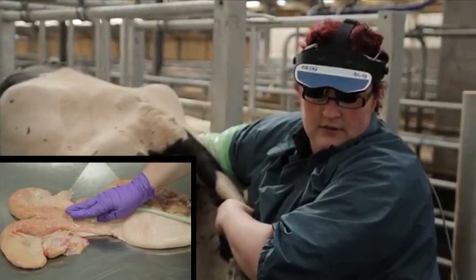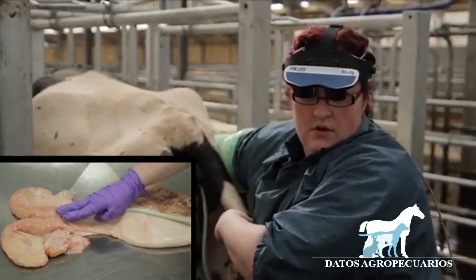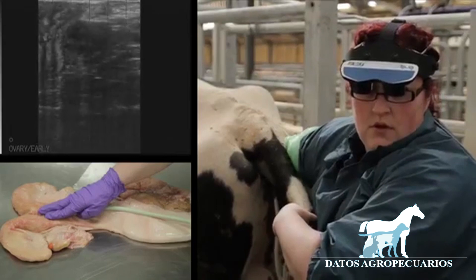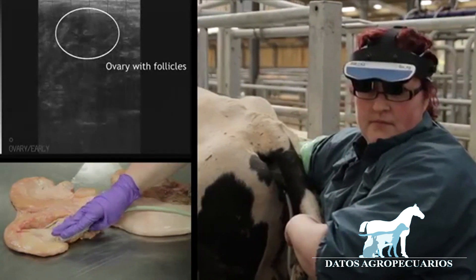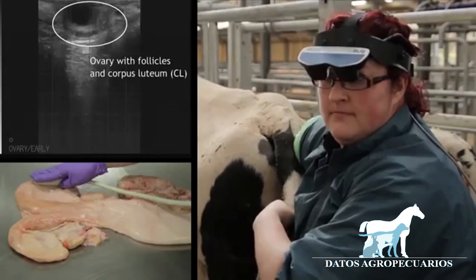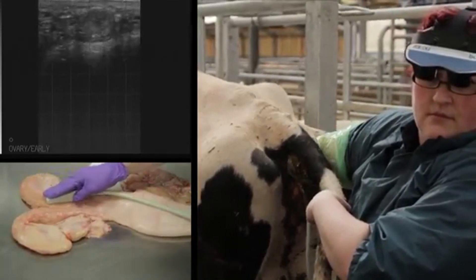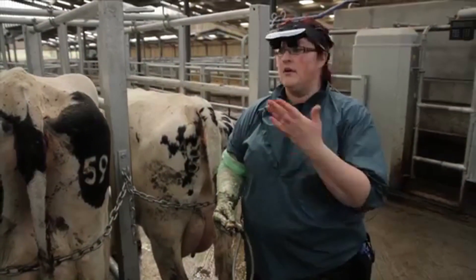Ensure you have good contact. Come to the body of the uterus, travel up one uterine horn up to the ovary, then come back down to the body of the uterus, up the other uterine horn, and evaluate the ovary on that side. Back to the body, and then out once more. This is the process that we follow to examine the reproductive tract using ultrasound in these cows.